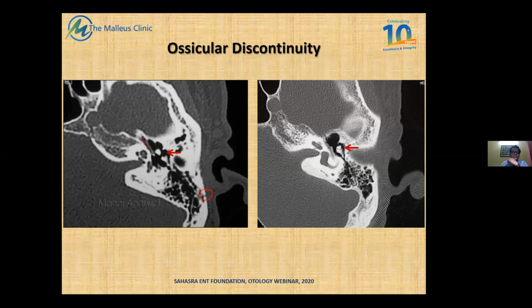This is again the tensor. This is not the facial nerve, friends, because your facial nerve is here. This is the sinus tympani, the facial recess, the basal turn and the apical turns of the cochlea with the osseous spiral, the internal auditory canal, the normal appearance here. Definitely the facial nerve tympanic segment. This is the facial nerve tympanic segment over here.